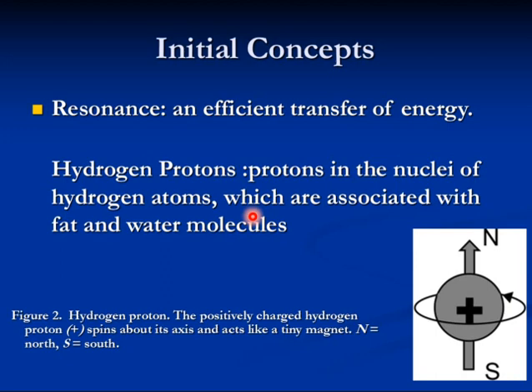So, every material, every element has a resonant frequency, has a certain frequency. If you give the energy in this frequency, it will be happy to receive it. Another example is a tuning fork. Exactly. The tuning fork, they use it in the ENT, it has a resonant frequency. If you hear it, it gives you a certain frequency. Okay, good so far?